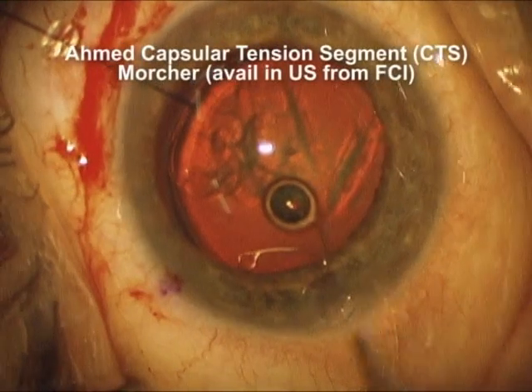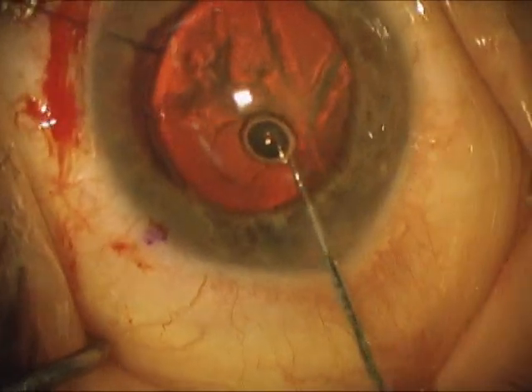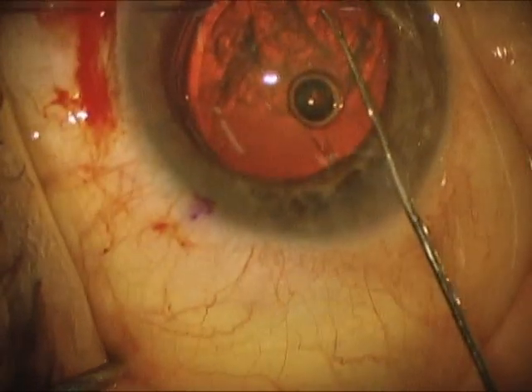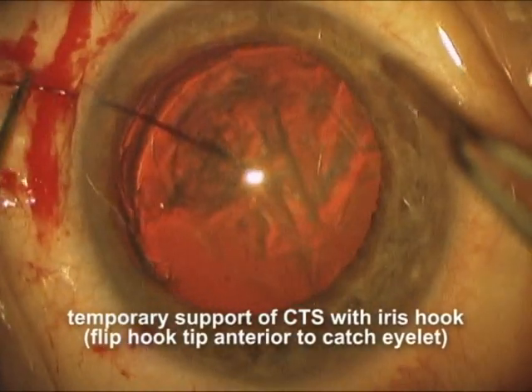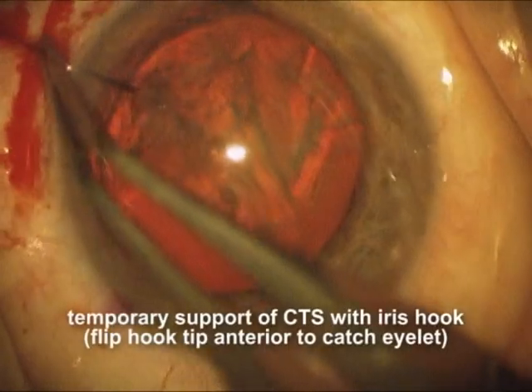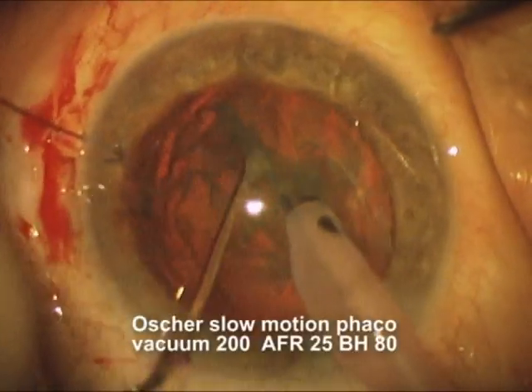Here's the Ahmed capsular tension segment. It's made by Morcher in Germany, but it's distributed in the United States by FCI. We're going to make sure that it's right side up so that the eyelet is more anterior than the ring segment. Now we're going to use the iris hook, pointing up, to capture the eyelet and pull the capsular tension segment over towards the area of the weak and missing zonules.